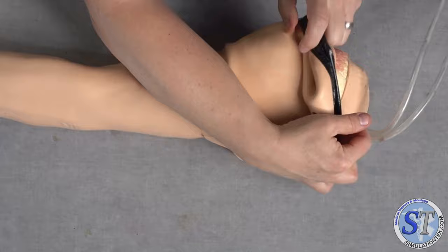First thing I'm going to do is just peel this arm back and see what we've got going on inside of it.